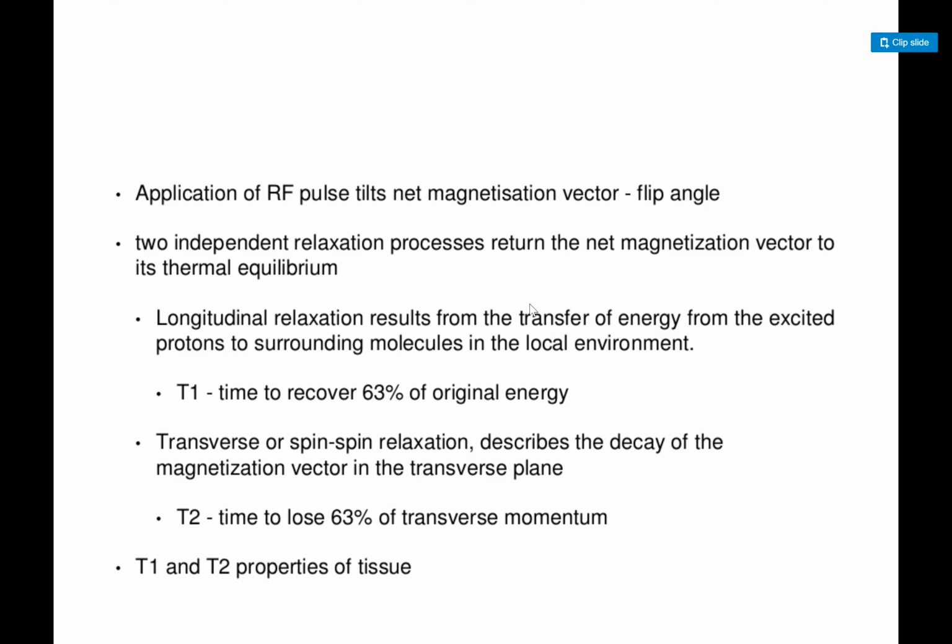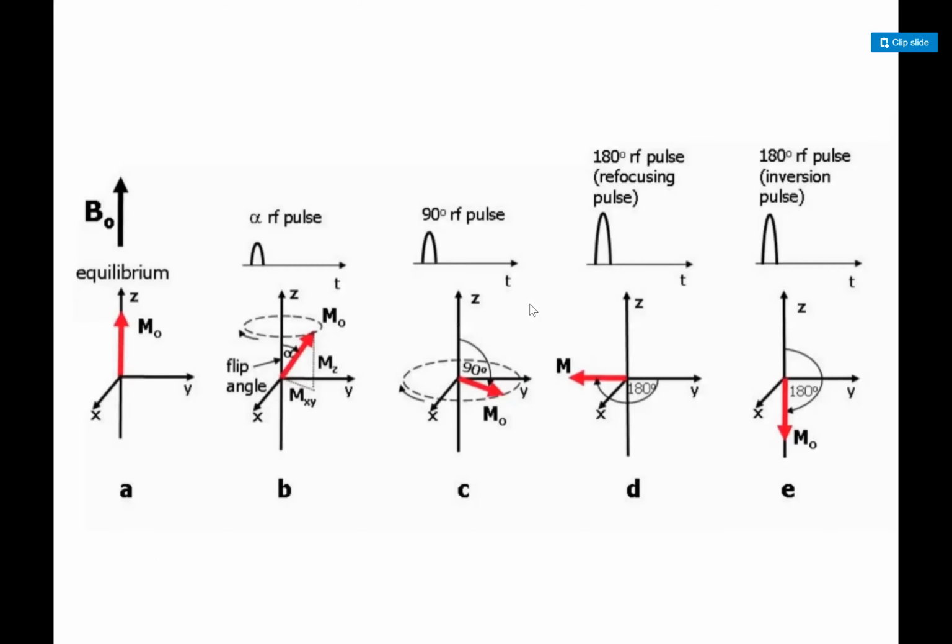And these T1 and T2 times actually tell us what type of tissue it is. They have different characteristics, and we have given them shades of gray on the MRI. Does anybody have any question here? Because this is an important concept of MRI.